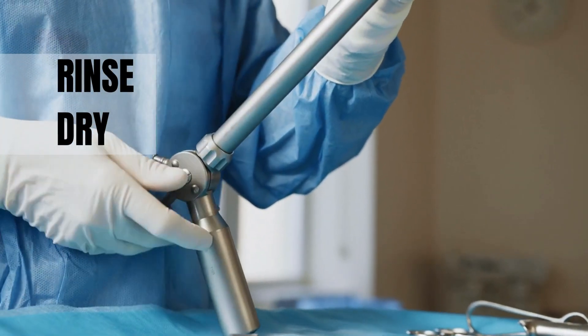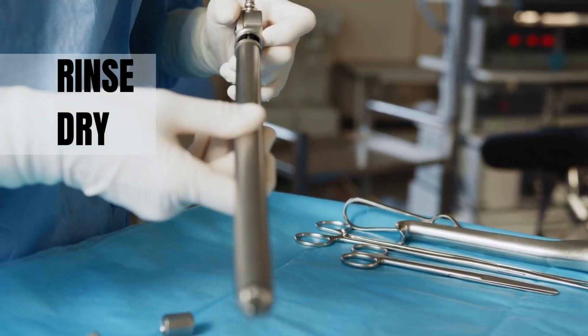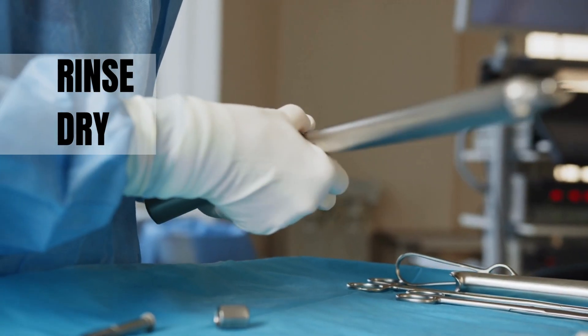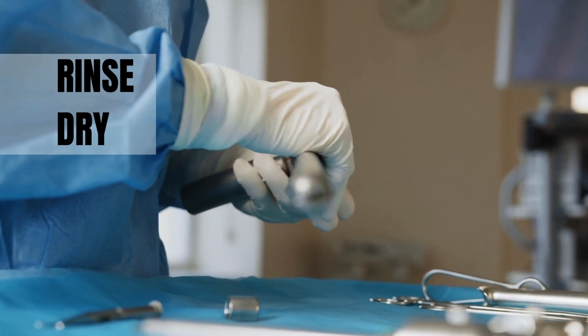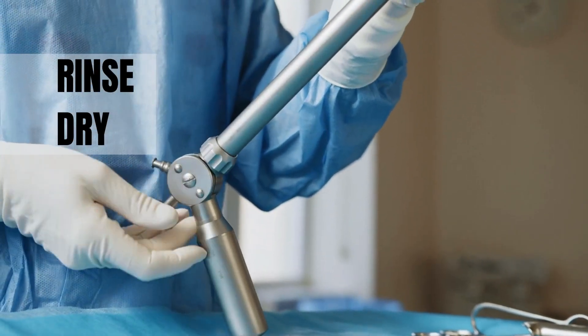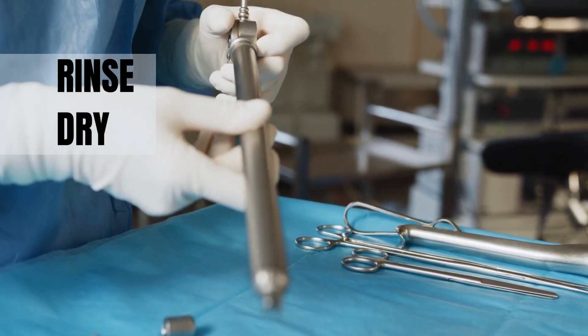Rinsing also helps in the removal of residual multi-enzyme cleaner on the instrument surface or in the lumen, which may later cause problems in patients. Rinsing is also helpful in preventing recontamination of the instruments when they are taken for disinfection or sterilization.